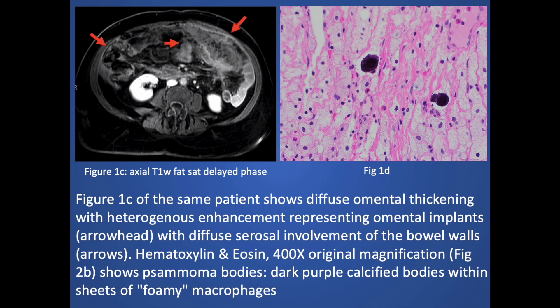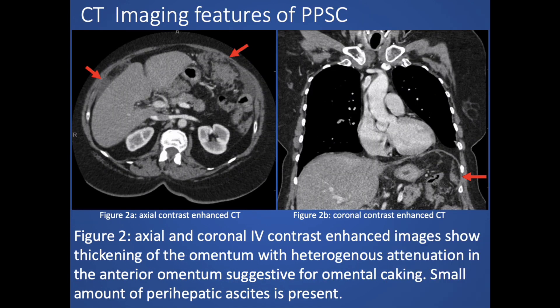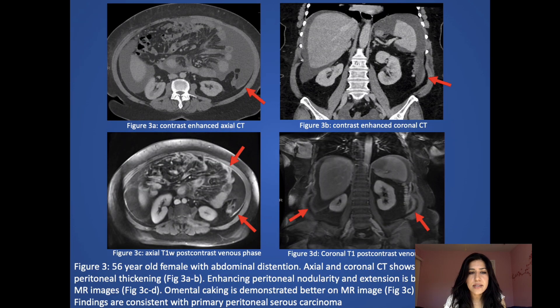Psammoma bodies are dark, purple, calcified bodies with sheets of foamy macrophages. This case shows the CT imaging features of primary peritoneal carcinoma. There is thickening of the omentum with heterogeneous attenuation in the anterior omentum, suggestive of omental caking.